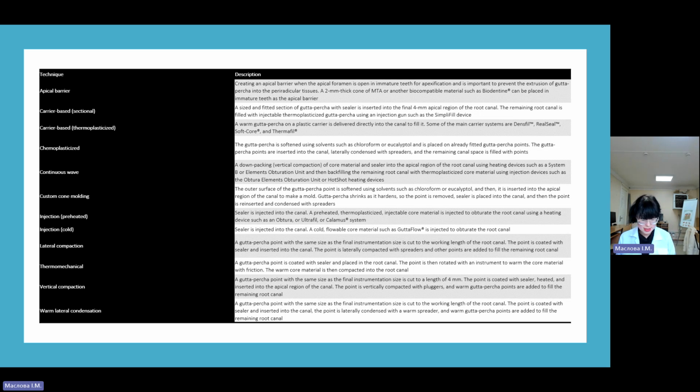Unlike other sealer types, HCSC sealers interact with their clinical environment, leading their chemistry to change accordingly. This characteristic has been termed bioactivity. They don't conform to the ISO standard for sealer ideal properties, which was developed for materials that are stable and whose chemistry does not change in use.